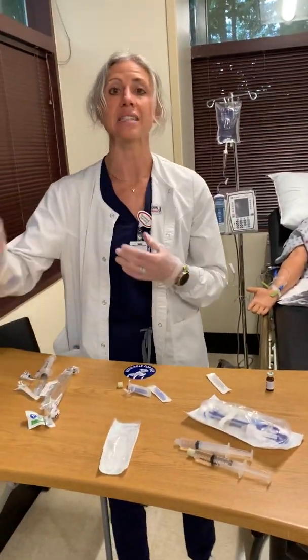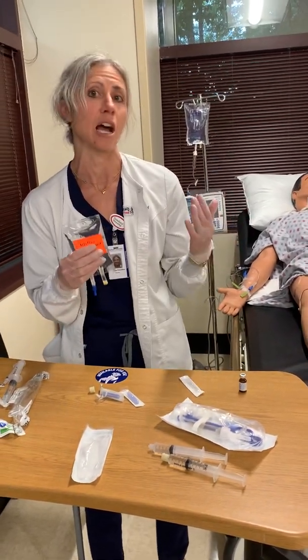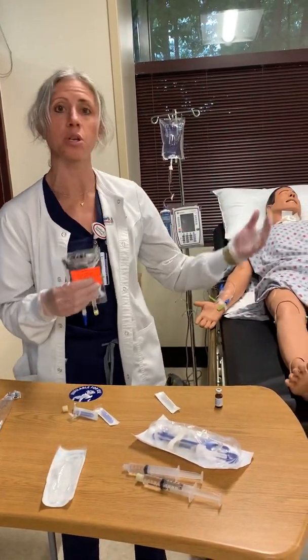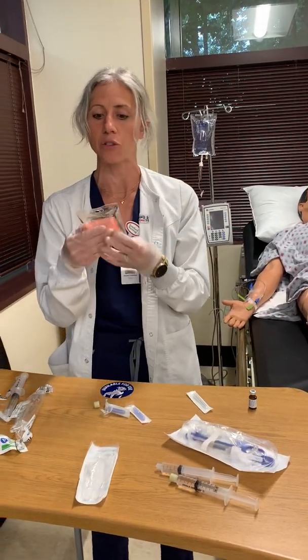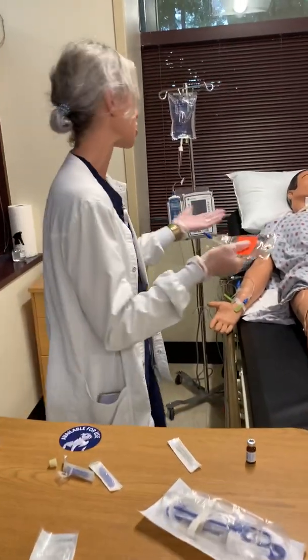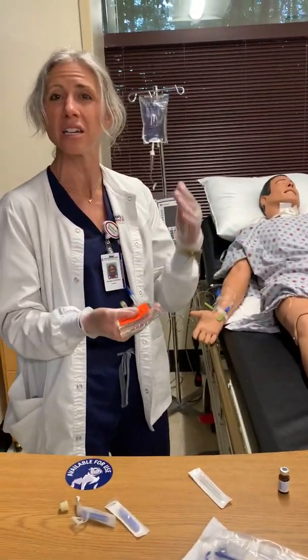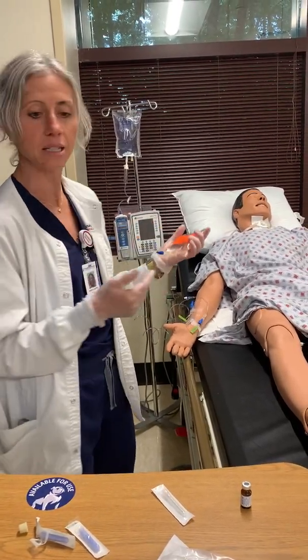Now, my patient had a secondary medication order. So I would go through all of the same things that I already did. I've gone to the computer. I've verified when I was at the Pyxis. I made sure I had the right patient. I made sure that I had the right drug. I've checked with the patient. I made sure that I checked his armband. I wanted to make sure I had the right patient. I've got my right drug. I want to make sure that all of that is in place.